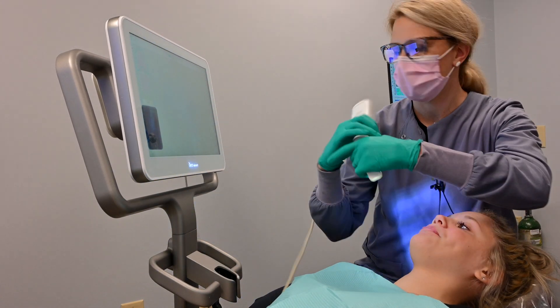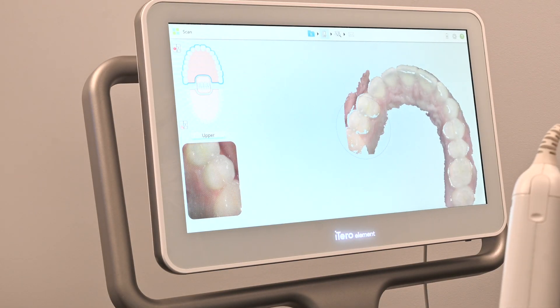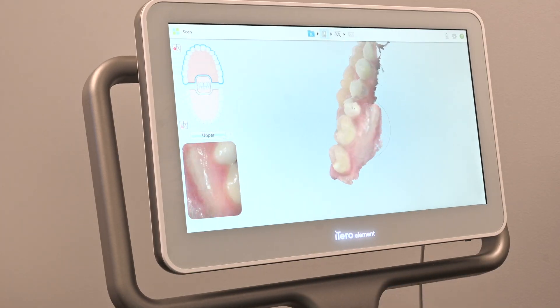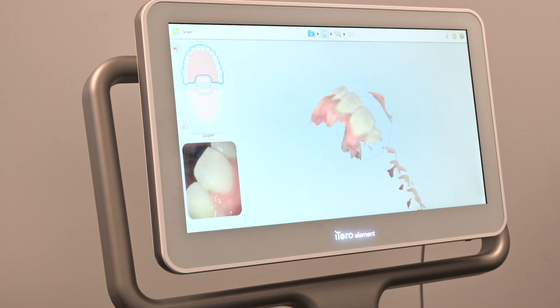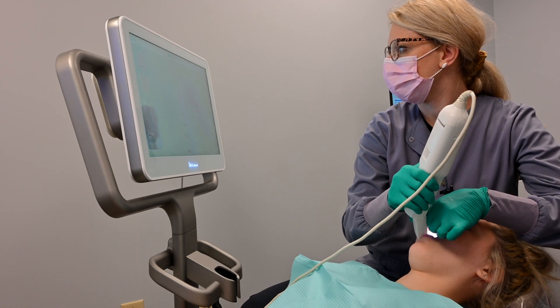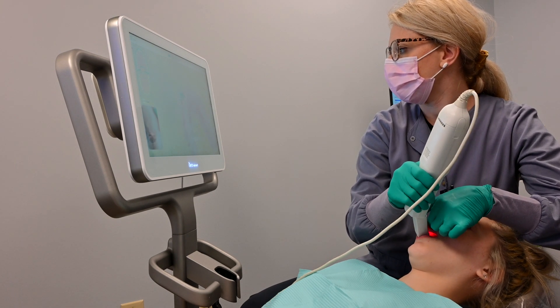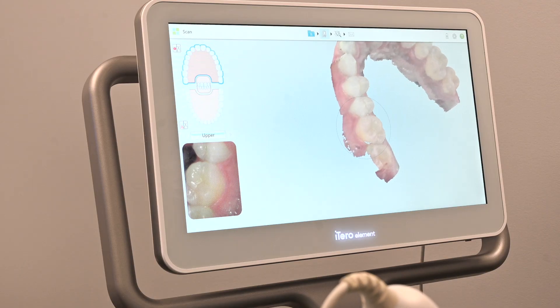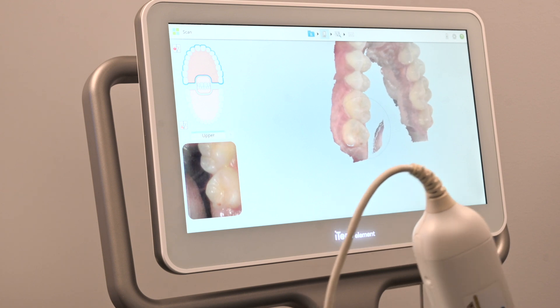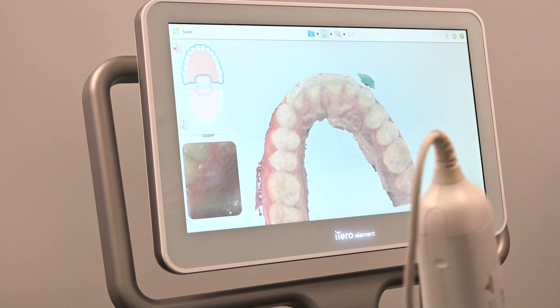We're going to go ahead and scan the upper teeth now. Along with using the iTero for Invisalign, we can also use this to fabricate models of your teeth for whitening. We also use it to digitally design crowns or implant crowns, which will help save us time and reduce human error compared to using traditional impression material.